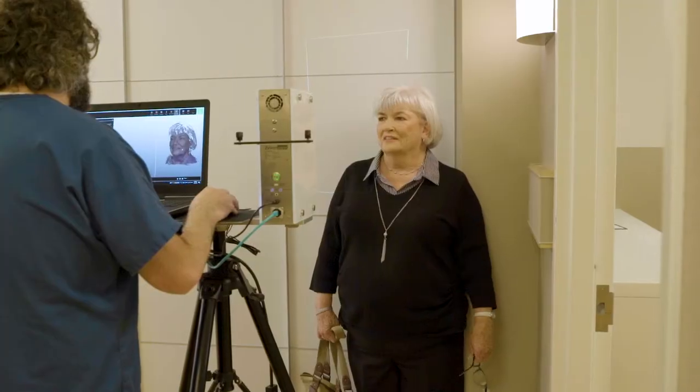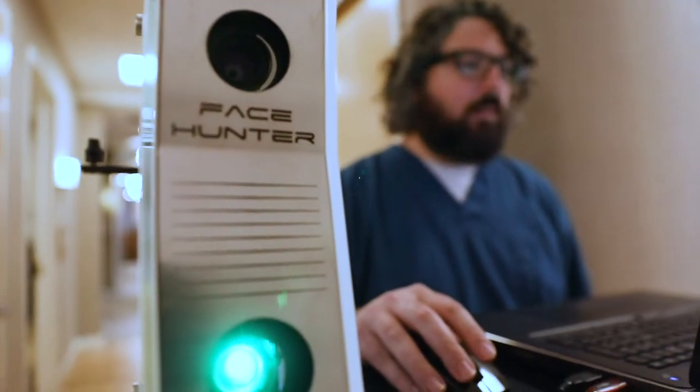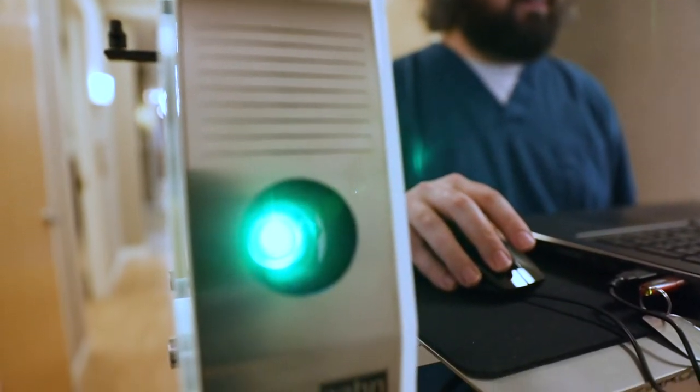We use this in our practice several ways. For orthodontic surgery, people come in and their bite's off, their teeth are off. We put them in a machine we have called the Zirkonzahn Face Hunter. It analyzes their face, combines it with their CT scans and a digital scanner, and we can do mock-ups, put them on their teeth, and see how they look.